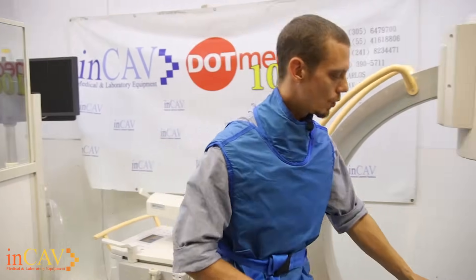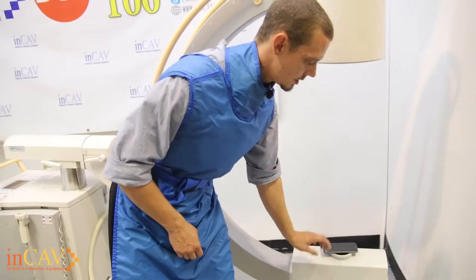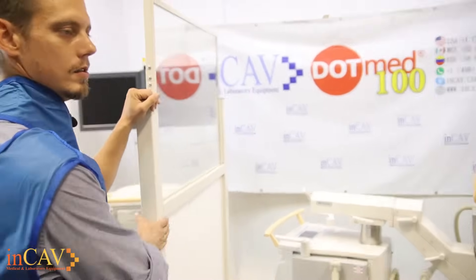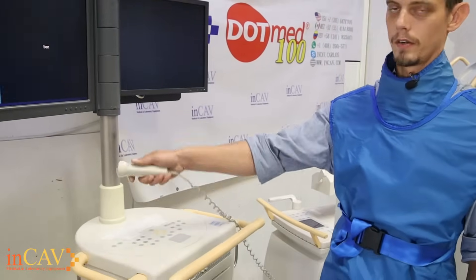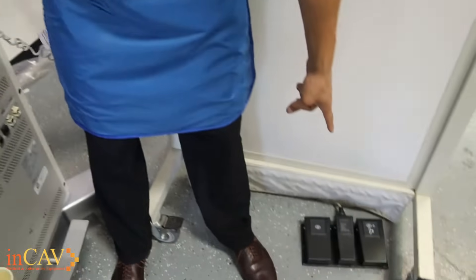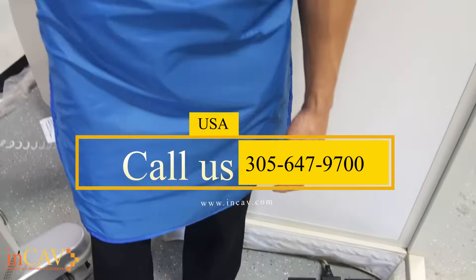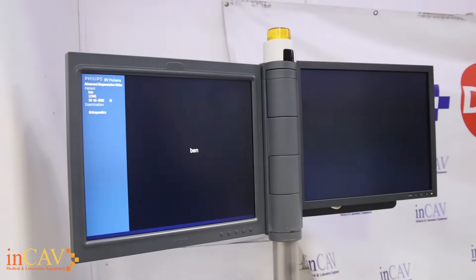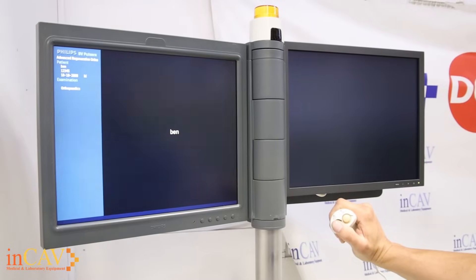Now we're going to get ready to take some images. Once you have the patient in position — we're going to use this as our patient today — keep in mind you want to make sure that you have your safety gear on. I have a lead vest here and also an X-ray opaque wall. The FDA requires this, so you want to go ahead and make sure you have that ready. There are a couple of different ways you can use the fluoroscopic machine: you have your hand control here, and then your foot pedal down here. It's completely up to you which one you'd rather use depending on the circumstance.